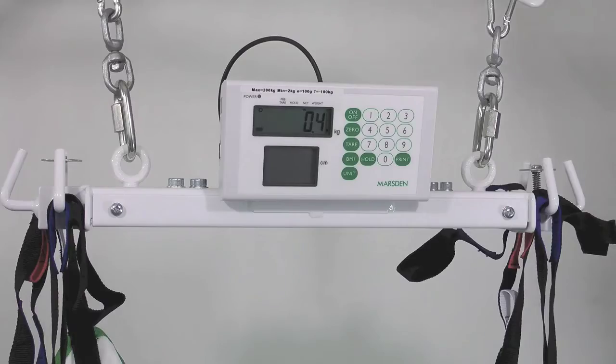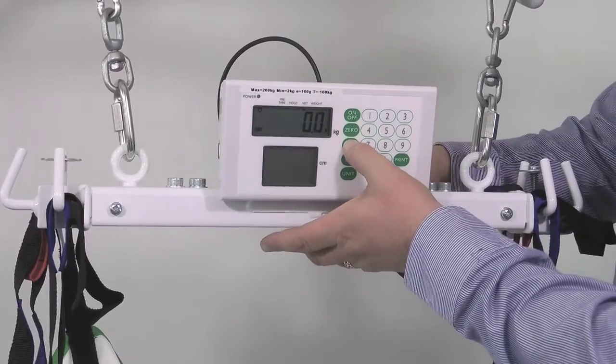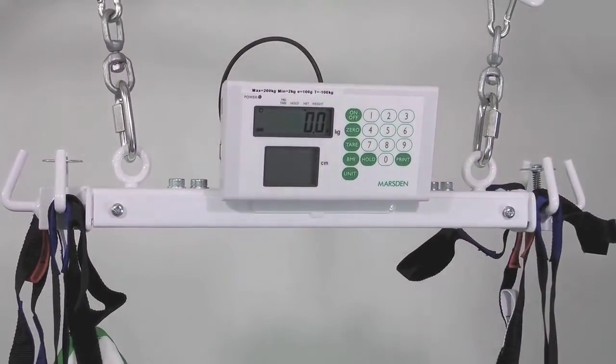Next, attach the sling to the hooks on the end of the weighing scale with the sling lifted off the floor or bed. Now press the tare button to zero the weight of the sling from the scale.